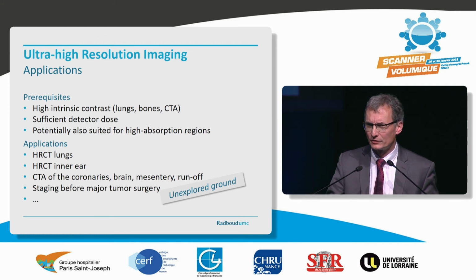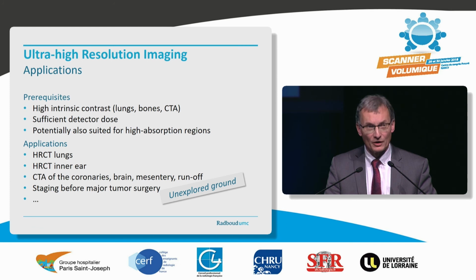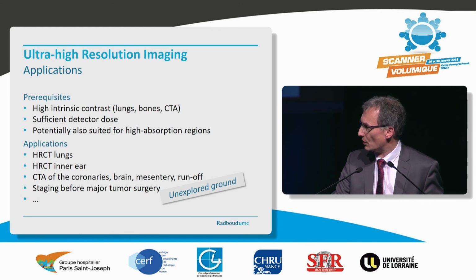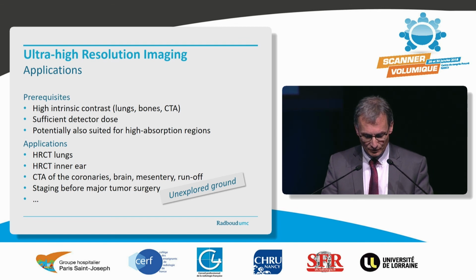And we've heard about the ALARA principle, as low as reasonably achievable, and that actually should go to the benefit of CT. And that is one of our most important indications now in our clinical practice. It's the staging before major tumor surgery. There actually radiation dose is really not important because the surgery is the important risk factor. So really optimizing the diagnosis beforehand is the most important factor.